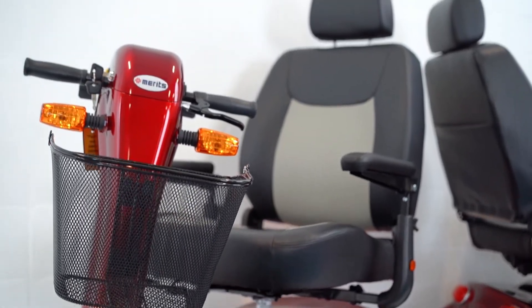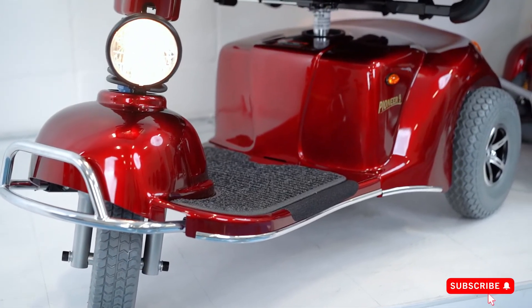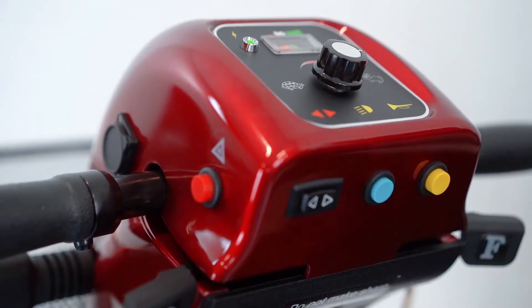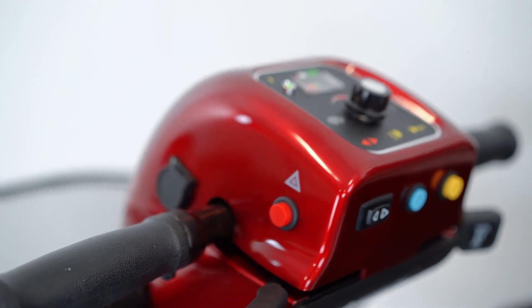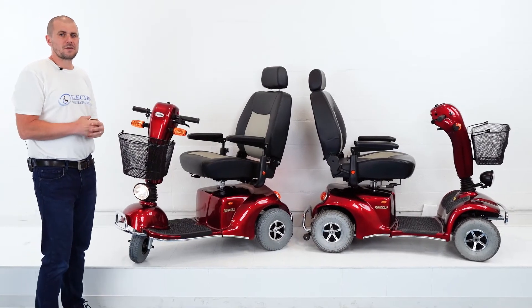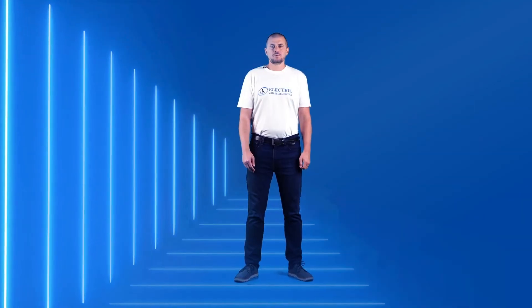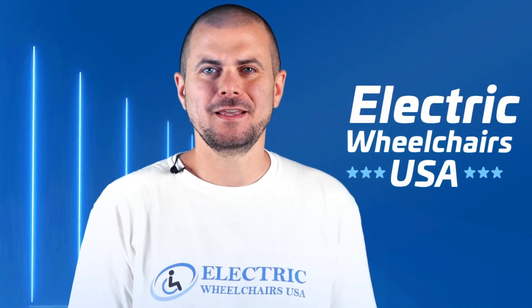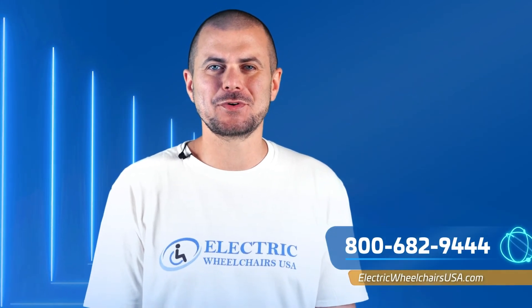In conclusion, if you're looking for a heavy-duty unit that can handle up to 500 pounds, the Pioneer 9 and Pioneer 10 are both great options. This unit has a nice retro style and is definitely one we recommend to our customers. For more information, visit ElectricWheelchairsUSA.com or call us at 1-800-682-9444.